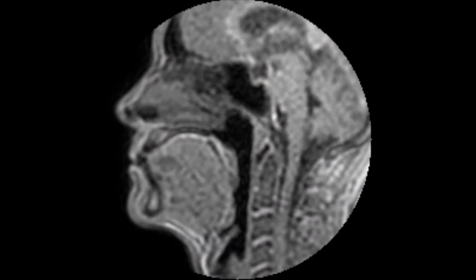Early on, we decided that we would tackle the research in two ways in parallel. The first is to use more or less standard sequences provided by the scanner manufacturer and improve them, so we can quickly develop a protocol that could be used in volunteers and in patients. The second is to go into more research sequences to obtain better anatomical images and better speech images. Very quickly we managed to develop a 3D protocol to image the musculature, and also to image during speech at roughly 10 frames per second. The next few images are an example of that sort of sequence.